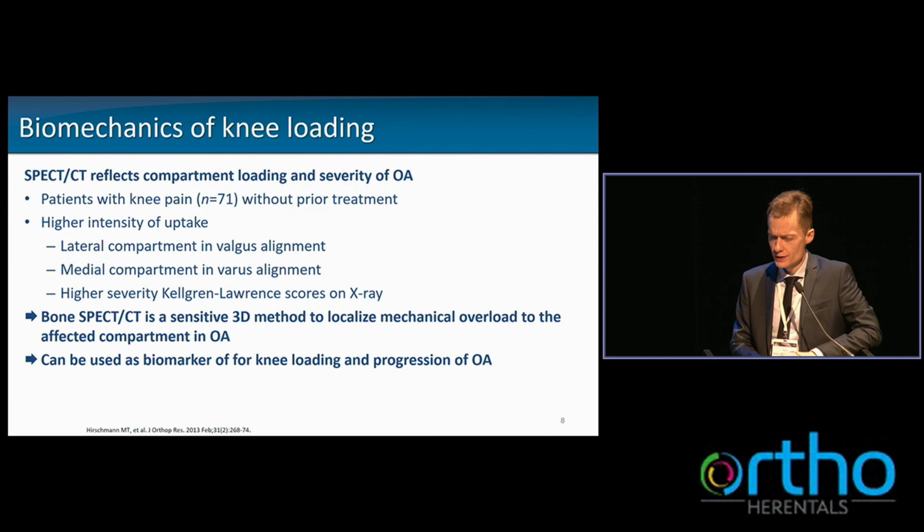And that brings us to the next big issue in bone scintigraphy of the knee, and that is the recognition that the biomechanics of knee loading is really crucial to understand what you are seeing on SPECT-CT. So we are realizing more and more that we need to take into account the biomechanics when we are reading these reports.